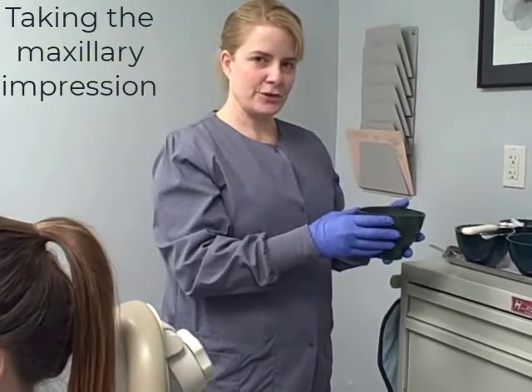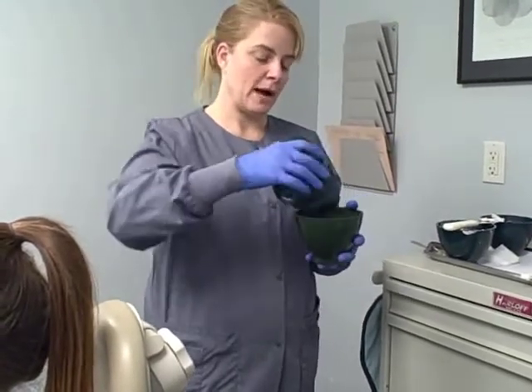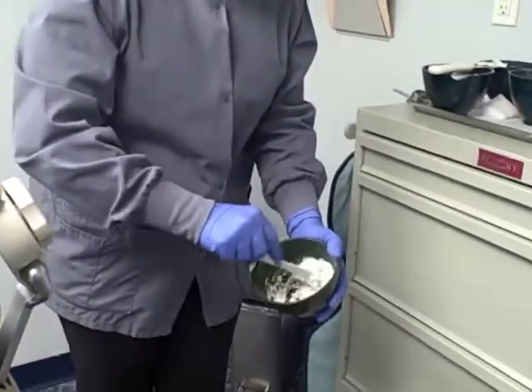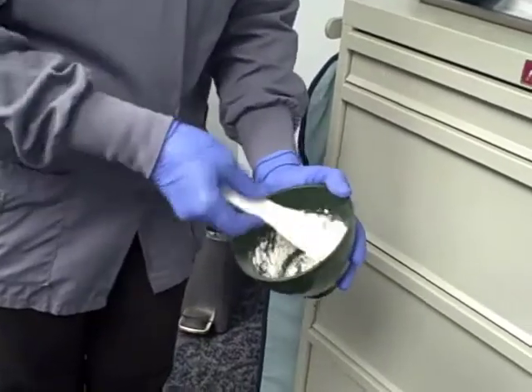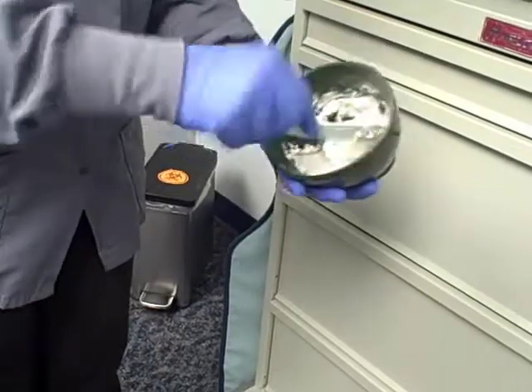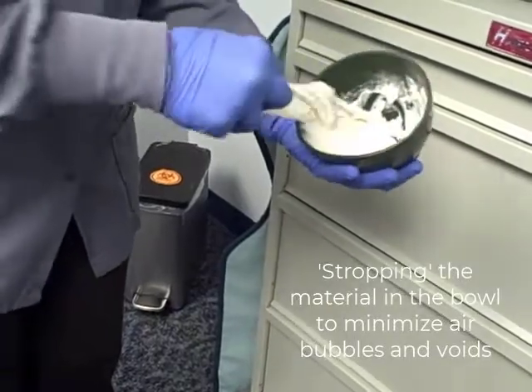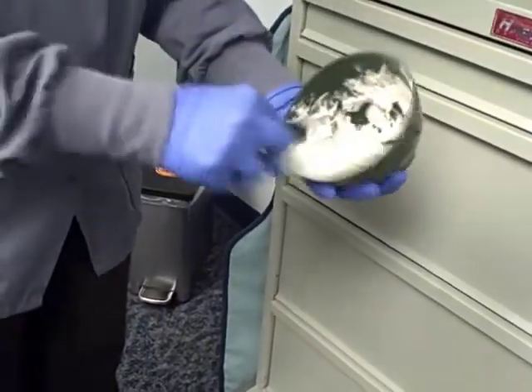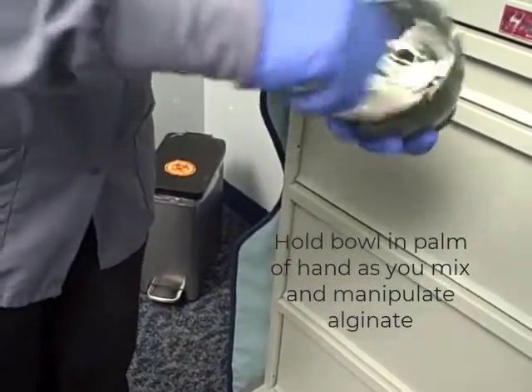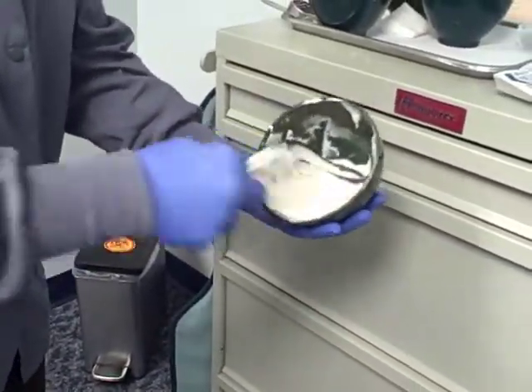Now we're going to do the maxillary impression. We have three increments of water and three scoops of powder. We're going to mix the powder into the water, and again mixing so that it's all saturated and wet. We're kind of scooping it up and just mushing it against the side — for lack of a better word.